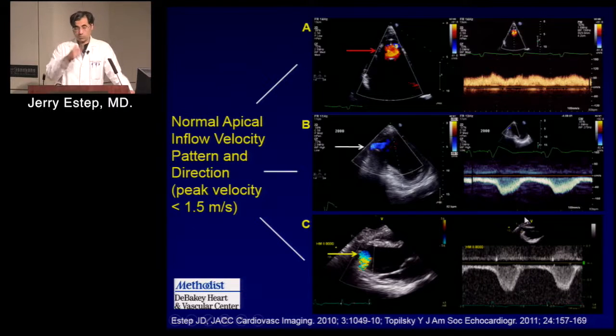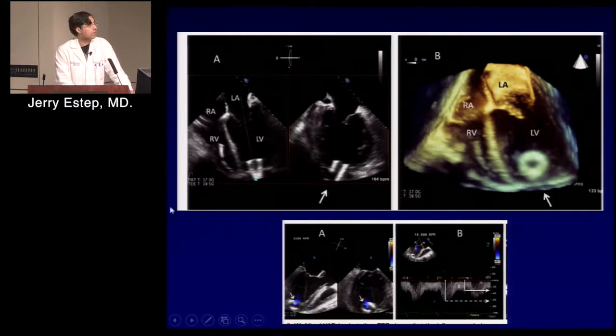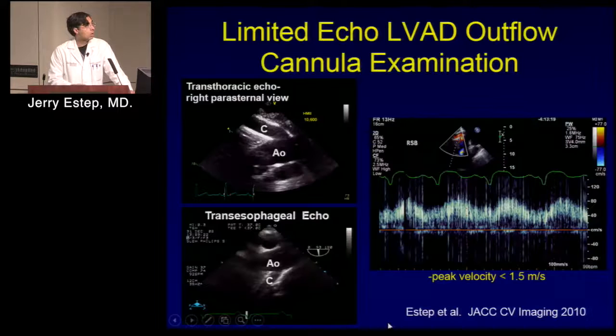Much like is true for screening for aortic stenosis in terms of the Reynolds number. You guys know what the Reynolds number is, right? More than 2 meters per second, obstructive sign. These velocities are significantly under 1.5 meters per second. And so we like to understand this coming off pump in the OR, and this is TEE. You really want to open up the apex. 3D can also be used. And so you want to understand that relationship to either the anteroseptum, septum, or the anterolateral wall.